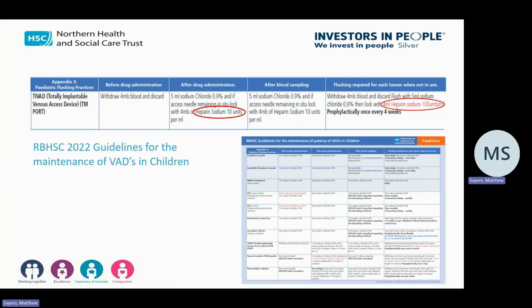Which does seem a bit strange, because everything else is weight related, but they've all got similar size. And that guidance doesn't offer anything on weight differential at all. So as Lisa said, it's the 4 mils, because you're not actually introducing it to the child. It is just the length of the line that you're clearing, but it's not something that you instinctively are always going to remember initially.